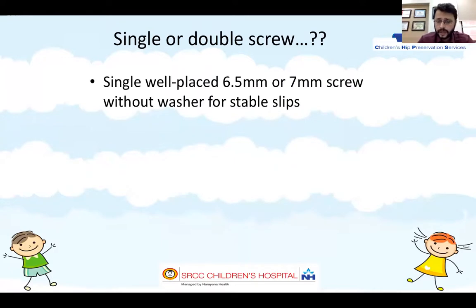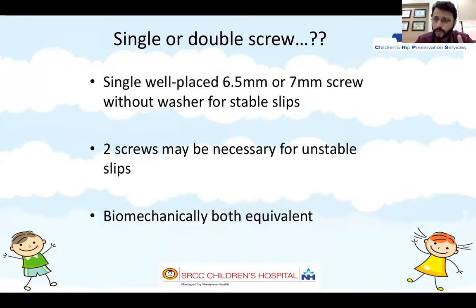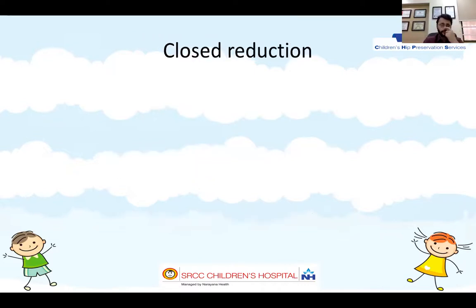Single or double screw: if it's a stable slip, you put a single screw. If it's an unstable slip, you may be tempted to put two screws, but again, it's equal biomechanically. If you are able to put a good single screw, then you can put a good single screw. Now, there have been various means.